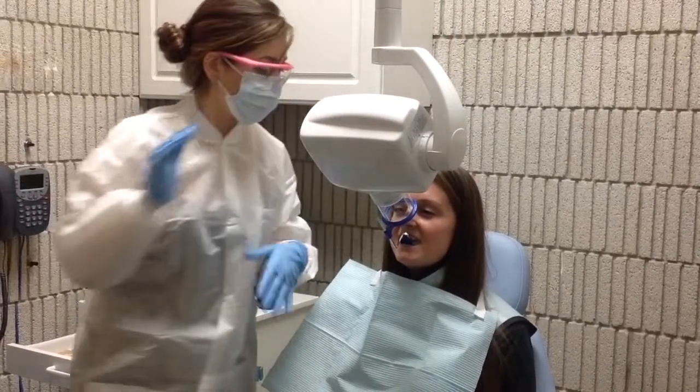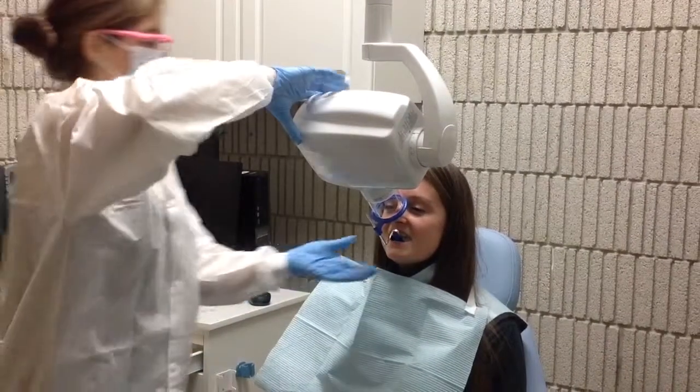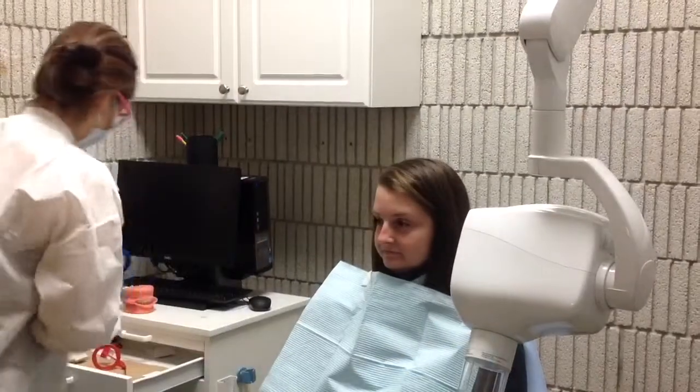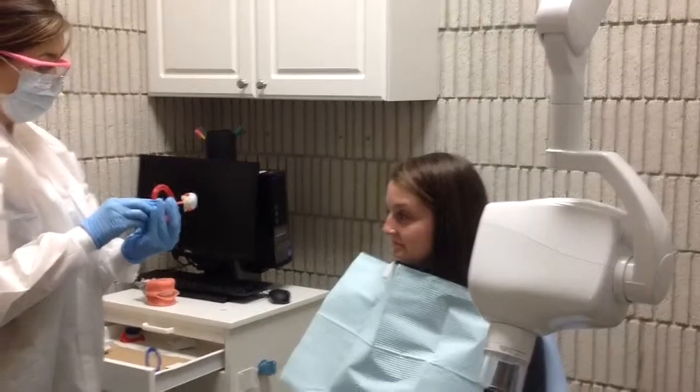You just stay super still. Beep. All right, and you can open. Awesome job. How was that? Good. Oops. All right, and the next one we're going to take is for the teeth on the side.